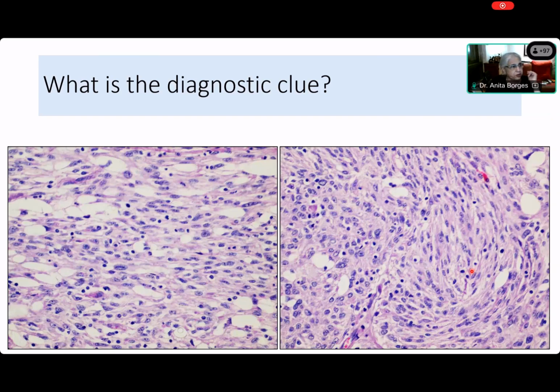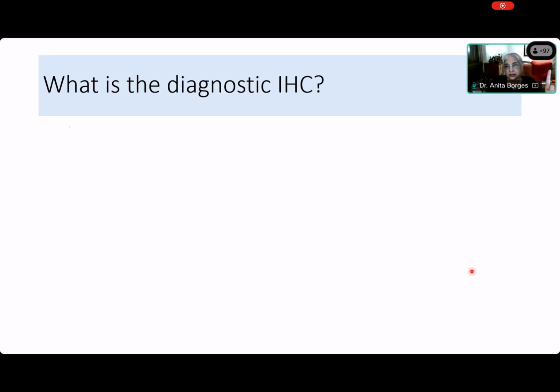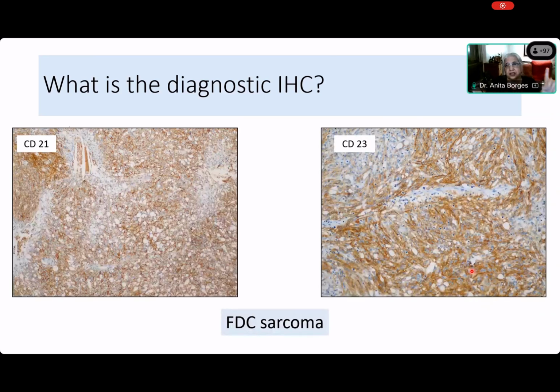So now, the person who wrote ALK, do you still want to do ALK? The answer is no. When I see lymphocytes and I see whorls, yes, now that person has got the diagnosis. I see minimum pleomorphism and I see only lymphocytes. And that's why I hate this term lymphoplasmacytic. There is no such thing as lymphoplasmacytoid, or whatever you people call it, infiltrate. These are only lymphocytes. You have a whorled appearance and lymphocytes, and there is only one diagnosis. And somebody has said it in the chat box. Do any of you know what that diagnosis is? Yes? What is it? It is an FDC, that is a follicular dendritic cell sarcoma, and you do a follicular dendritic cell marker.